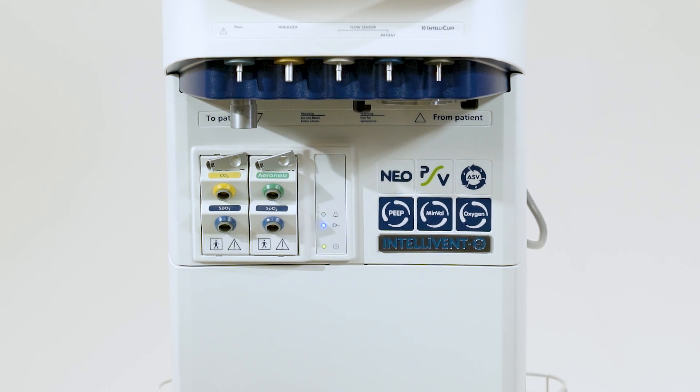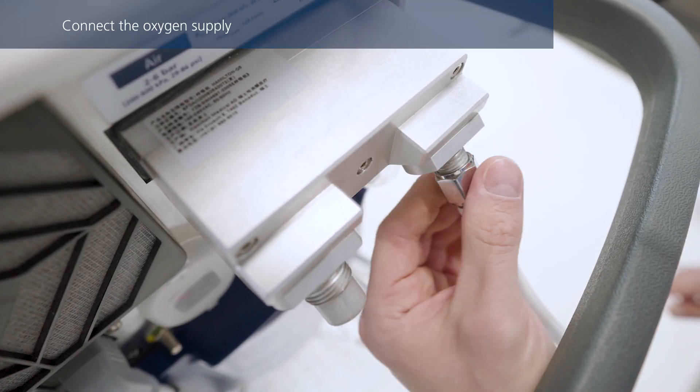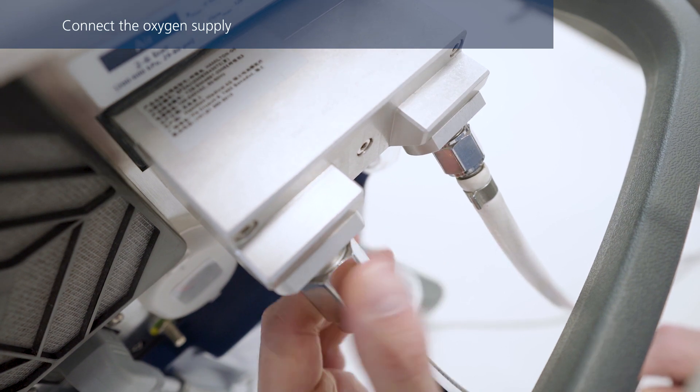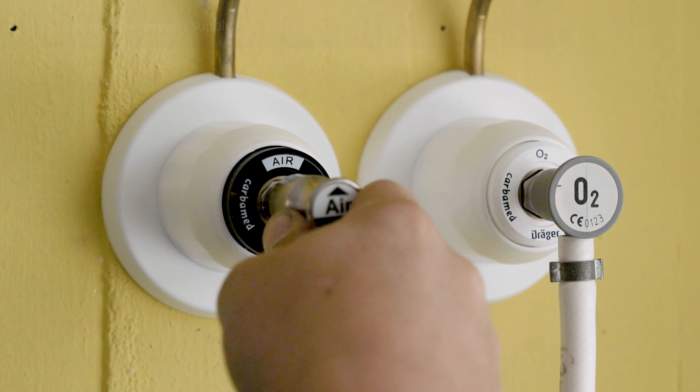Make sure the ventilator is connected to a power source prior to starting ventilation. If you haven't done so already, connect the oxygen and air gas hoses to the ventilator and then to the gas supply or gas cylinder.